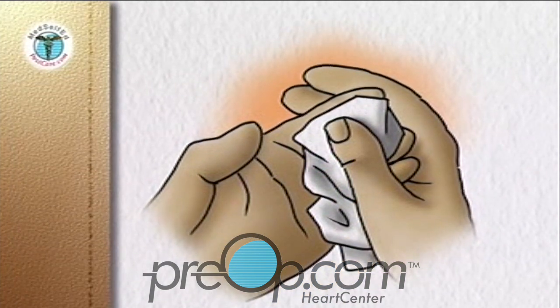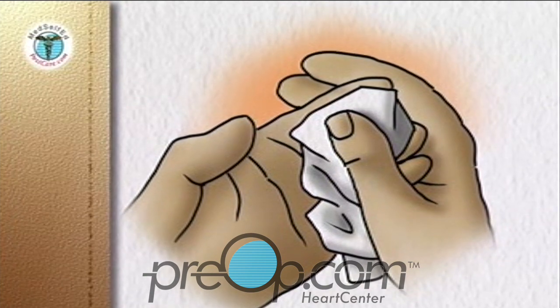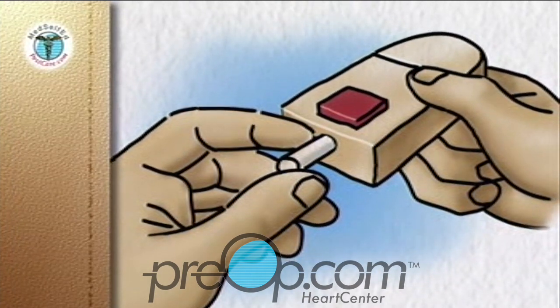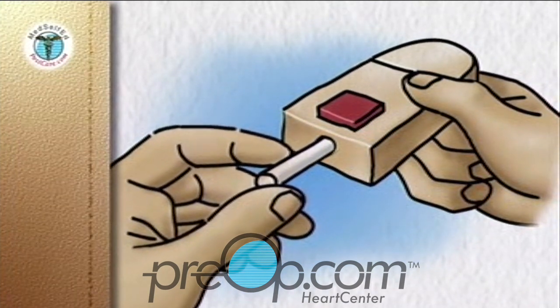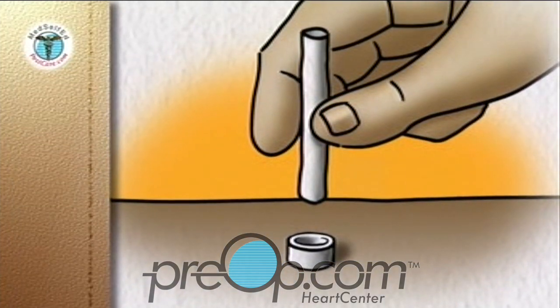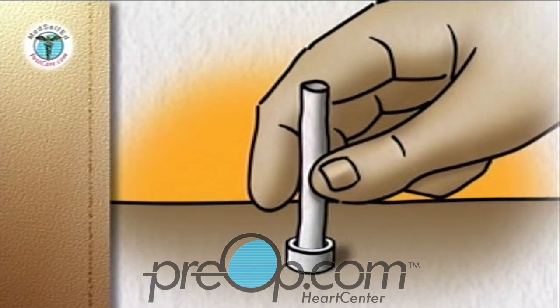Wipe the puncture site with a clean, dry facial tissue and use the tissue to hold pressure on the puncture site until the bleeding stops. Remove the end cap from the lancing device and remove the used lancet. Replace the used lancet back into the protective cap by pushing it into the open end of the cap, which is placed on a firm, flat surface like a countertop.